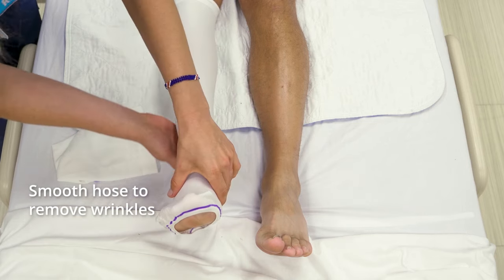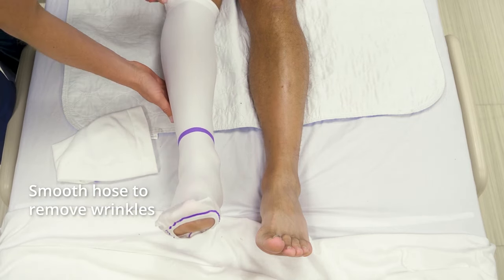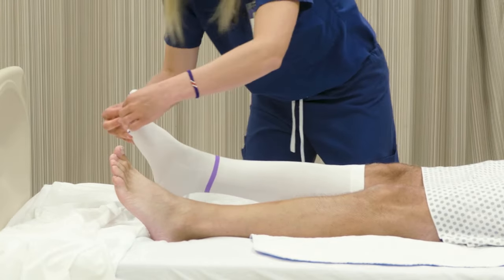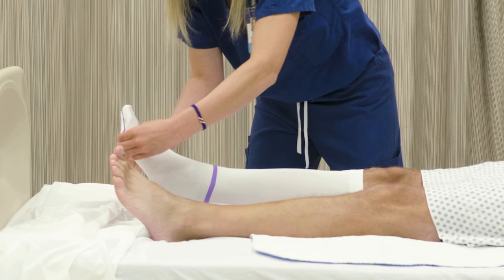Ensure that there are no twists or wrinkles by carefully smoothing the hose. Make sure the heel portion is positioned under the heel, and the toe opening, if present, is under or over the client's toes.